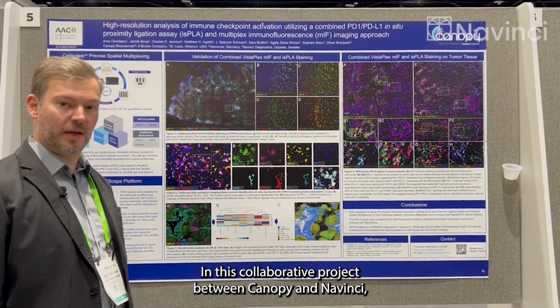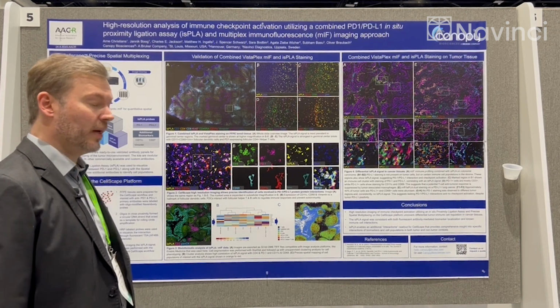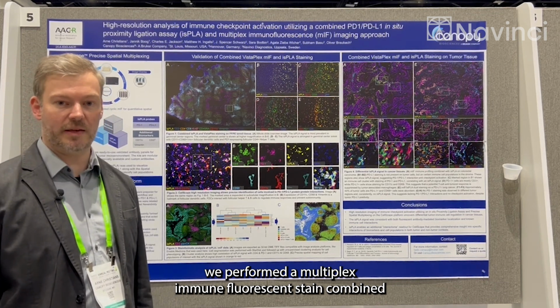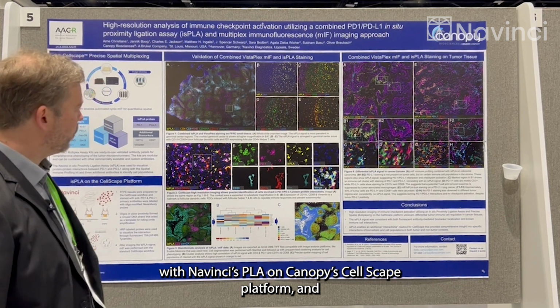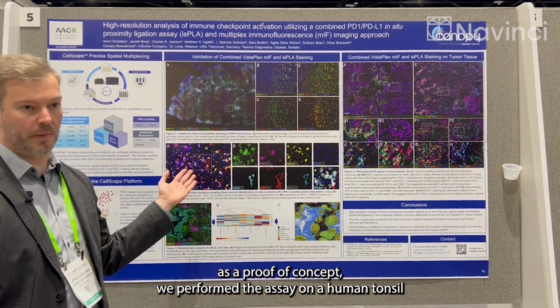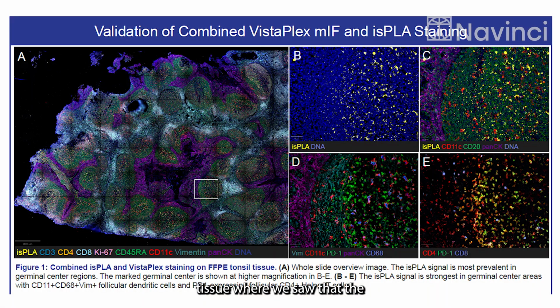All right, in this collaborative project between Canopy and Navinci, we performed a multiplex immunofluorescence stain combined with Navinci's PLA on Canopy's CellScape platform. And what we did first, as a proof of concept, is we performed the assay on a human tonsil tissue, where we saw that the PLA signal was mainly localized to germinal centers.